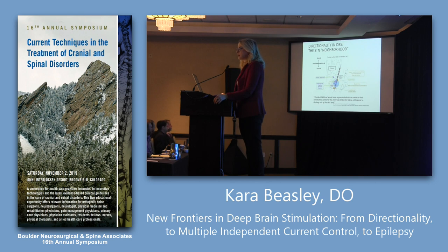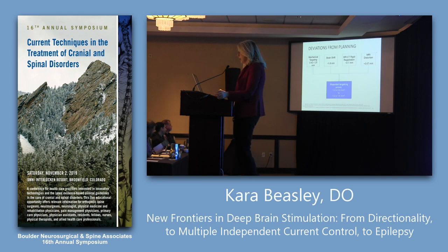But what if the lead's poorly placed? What if it's not actually in STN? What if it's a little bit lateral by a millimeter or two? And you provide circular or ring-type stimulation. What you get is a whole bunch of side effects that people can't tolerate. Instead, with directionality, you can literally turn on those more medial contacts, turn off the lateral contacts, and you can take a lead that's not well-placed and turn it into an effective lead from a programming or stimulation standpoint. So here's a study that shows how much deviation is there from planning.